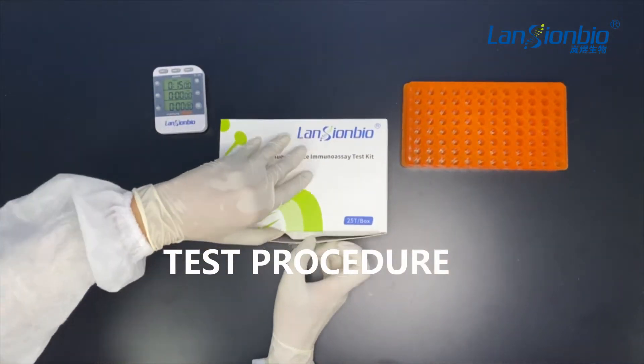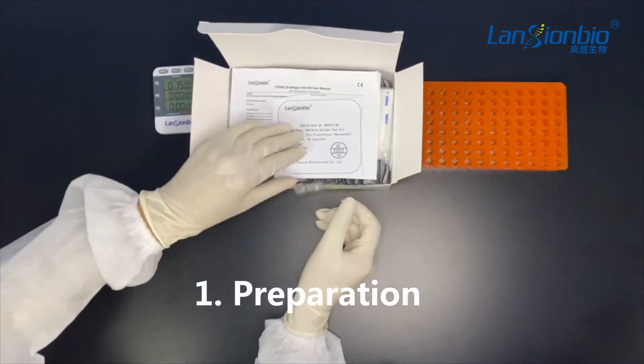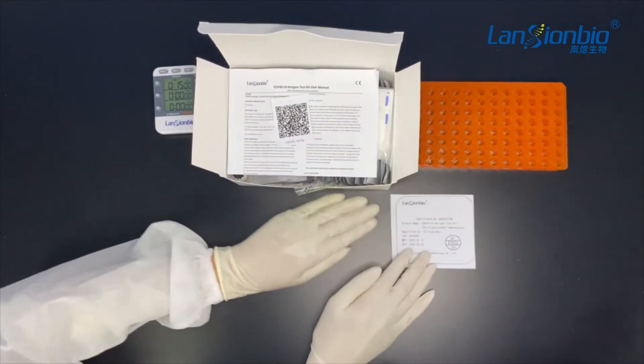Test procedure. Today I will show you the whole test procedure of COVID-19 antigen test kit preparation.